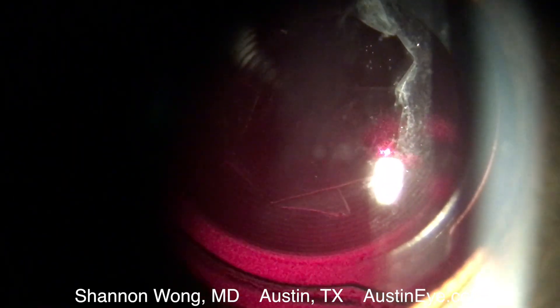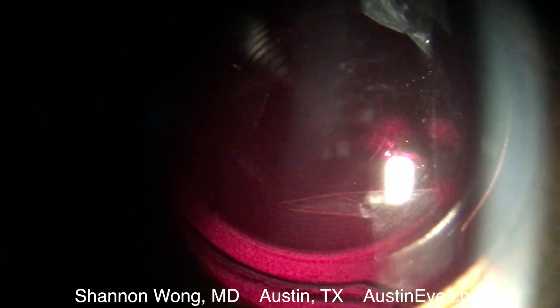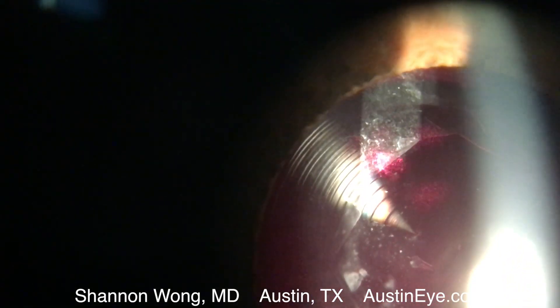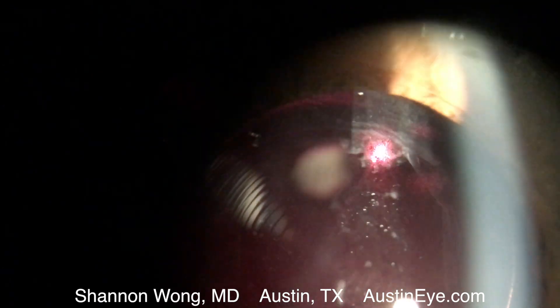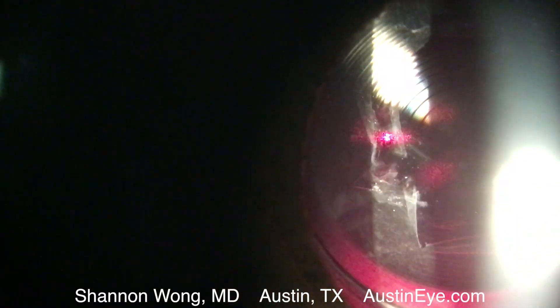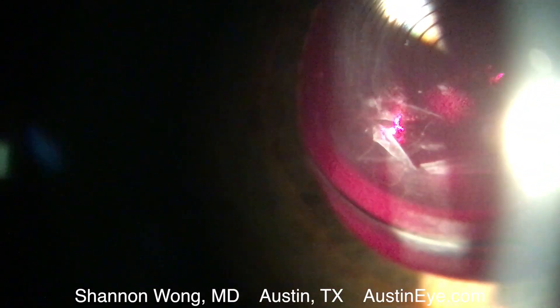The energy of the YAG laser creates a small microburst that allows us to open the capsule exactly where we want it. The laser passes harmlessly through the cornea and through the implant. We assemble a series of these small YAG laser pulses and create an expanding circular opening through which the patient can gain a clearer view.